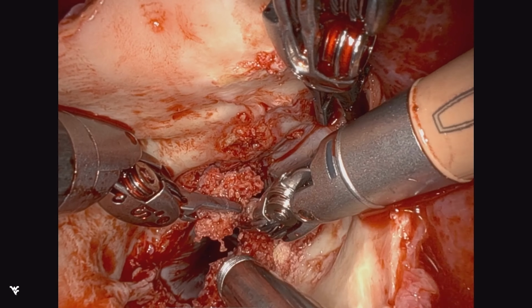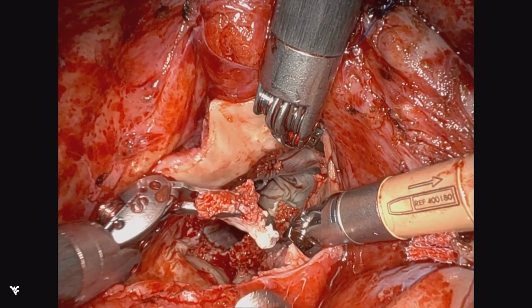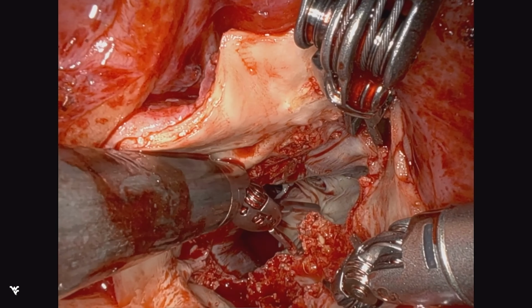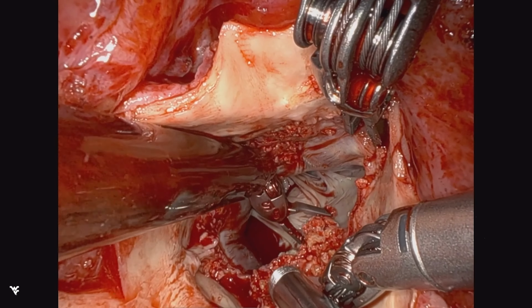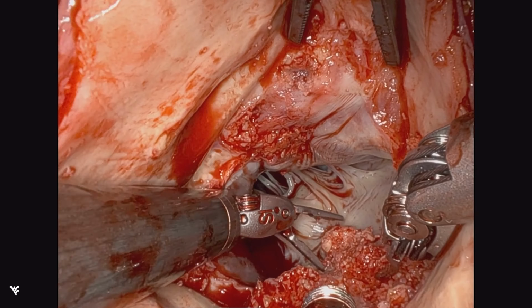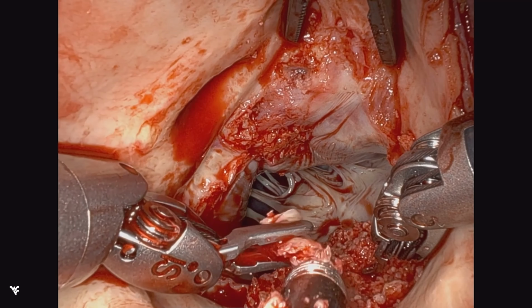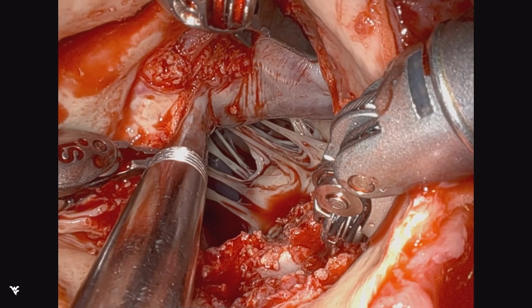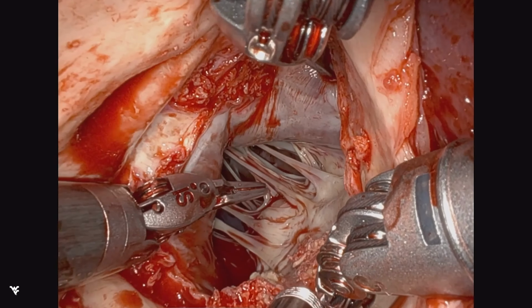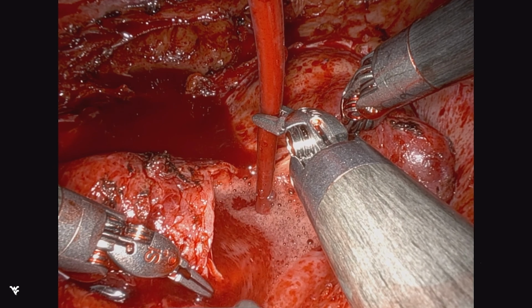And oftentimes, transaortic debulking of this large chunk of calcium, particularly if it comes off in a seamless way, can actually have other advantages to the hemodynamic performance of the mitral valve in terms of its motion with minimal or reduced restriction. Sometimes this can be done, as you just saw, by squeezing the calcium, and then it somewhat peels off, sort of akin to what a rongeur movement would do, but without the need of a rongeur. So once we've debulked all of this, we then spend a lot of time with very aggressive irrigation.